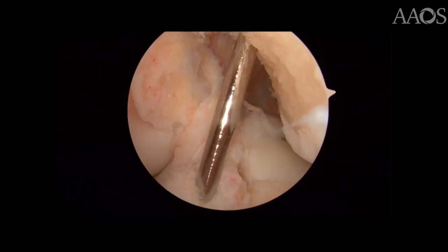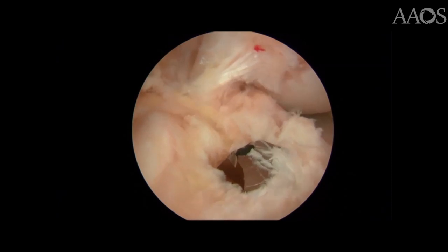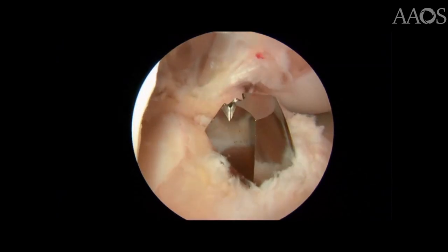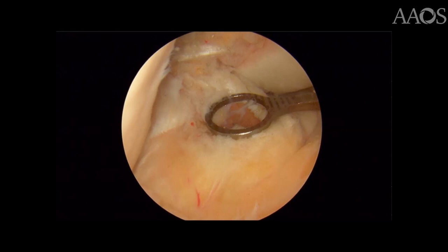When reaming the tibial tunnel, it is helpful to dock the guide pin into the femur to avoid any unwanted movement. This clip shows the reamed tibial tunnel to be in the center of the native ACL tibial footprint. Note the location of the anatomic tibial tunnel created in line with the anterior horn of the lateral meniscus and adjacent to the medial articular cartilage.